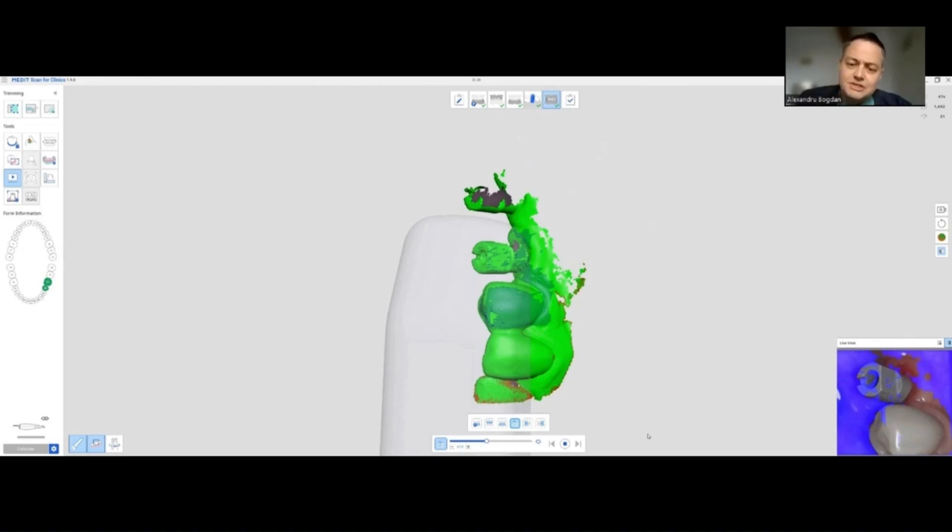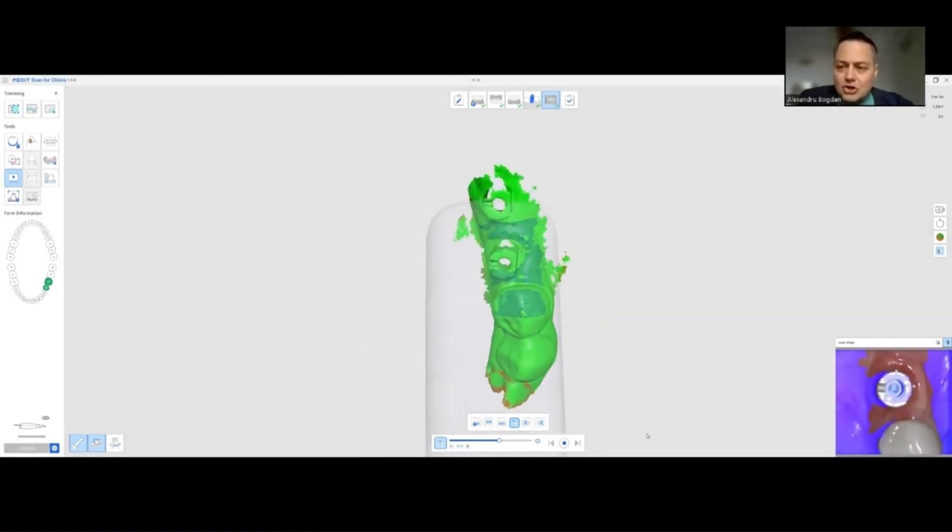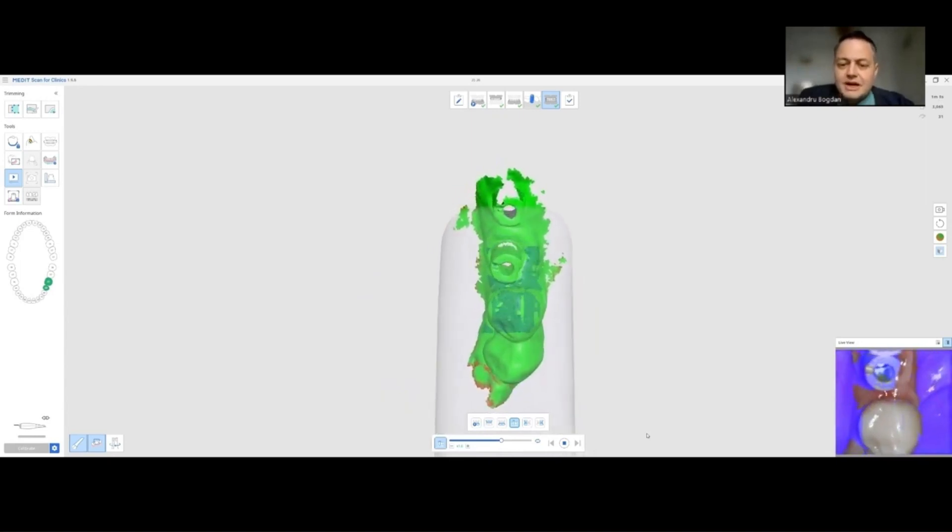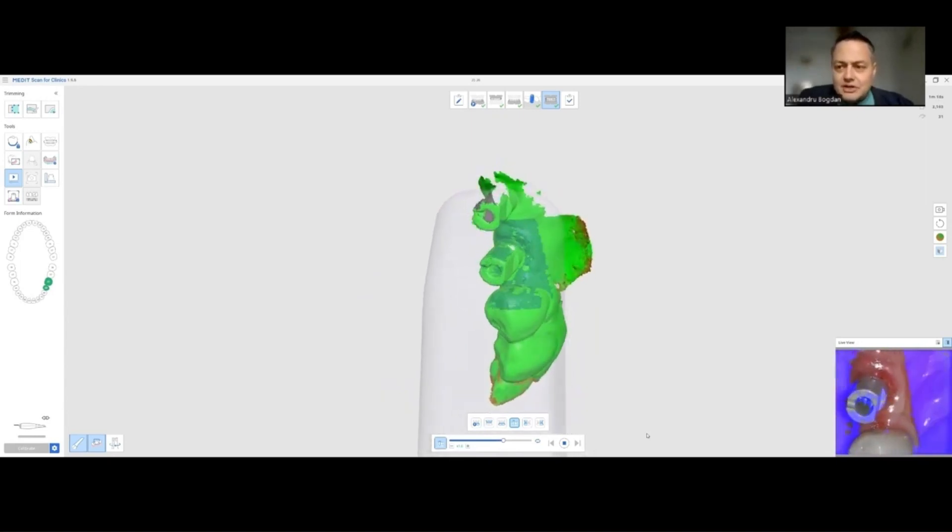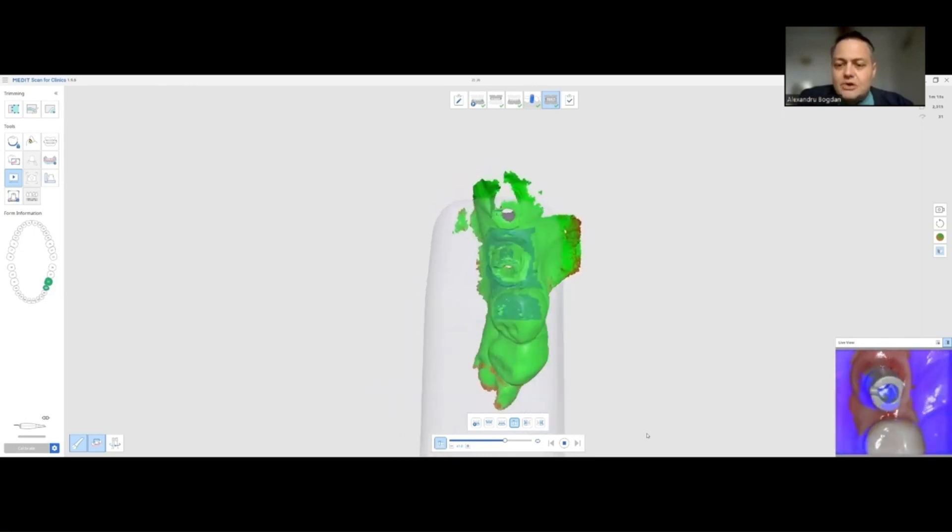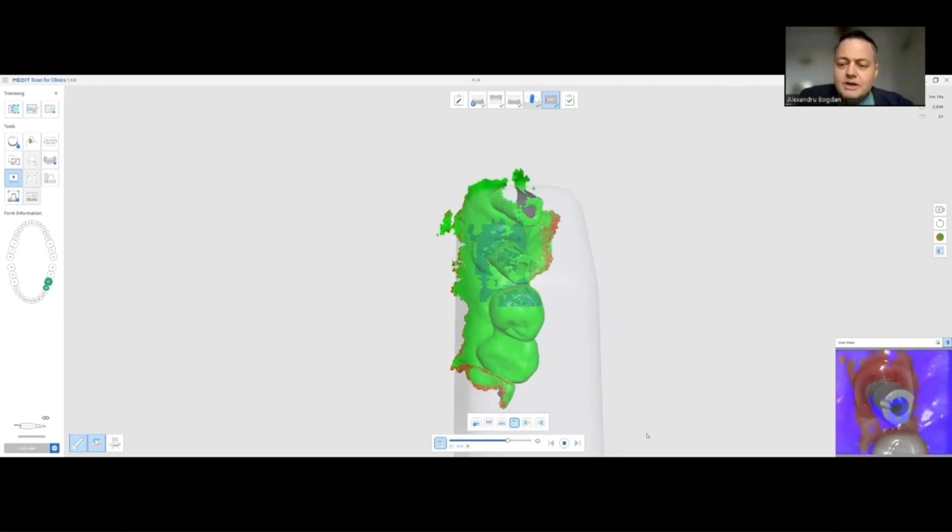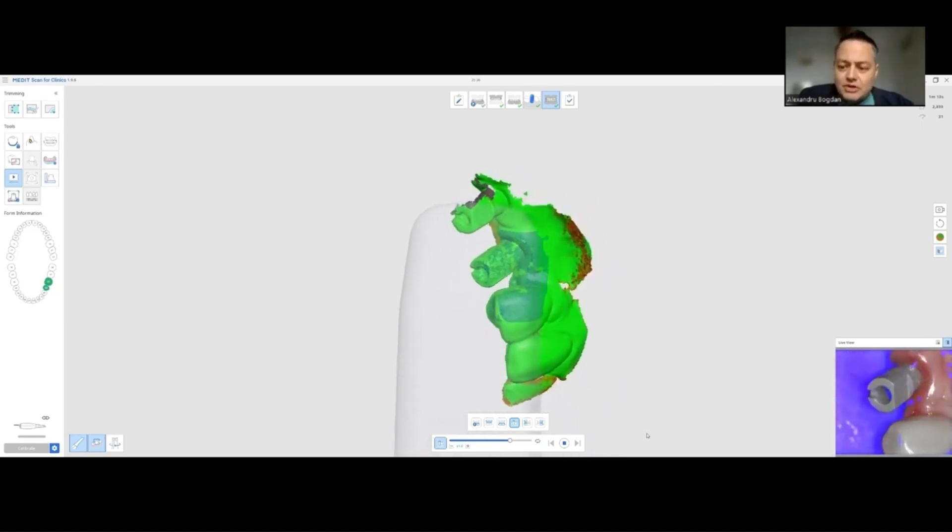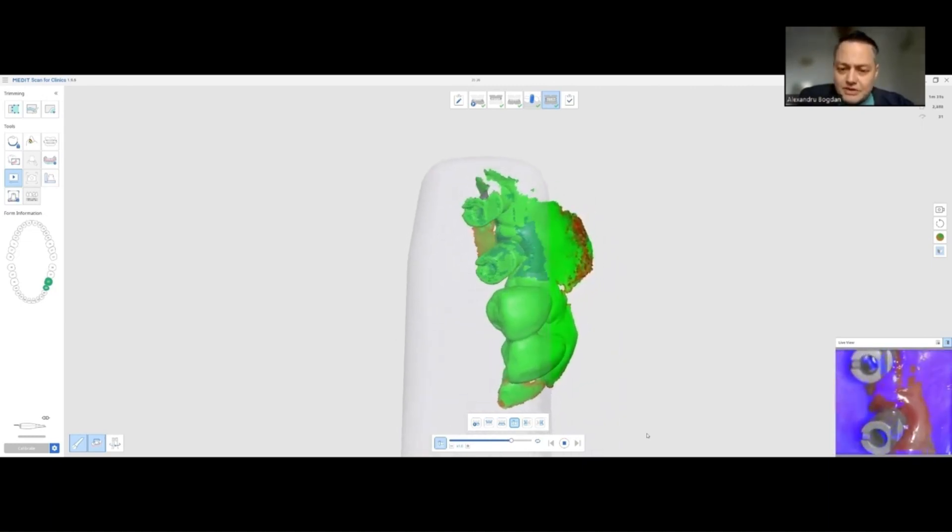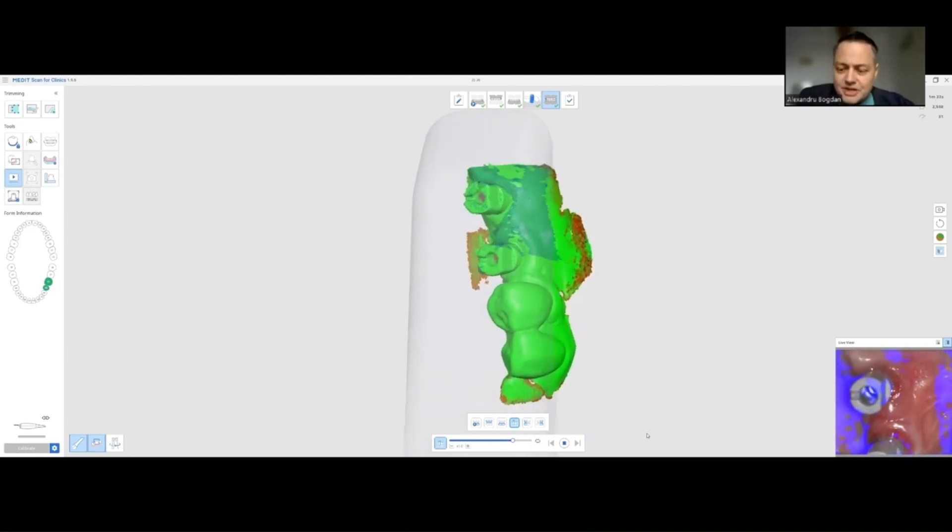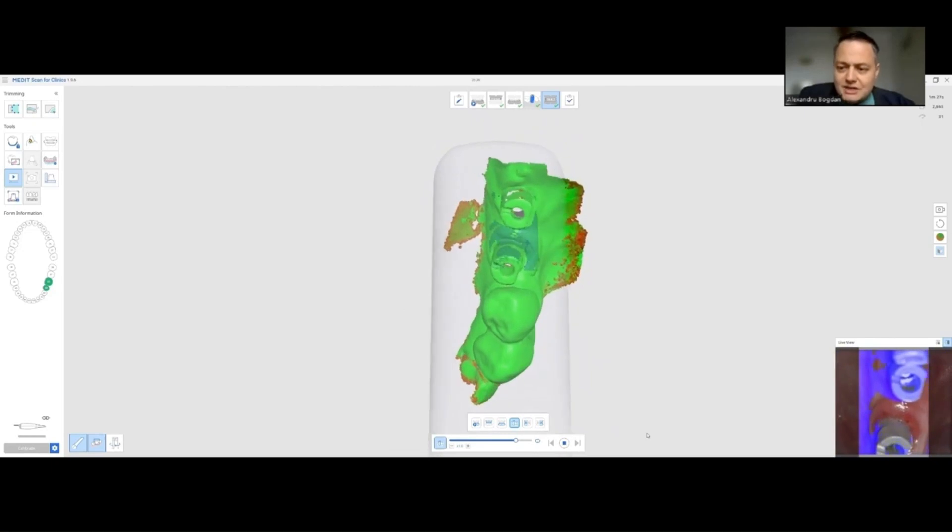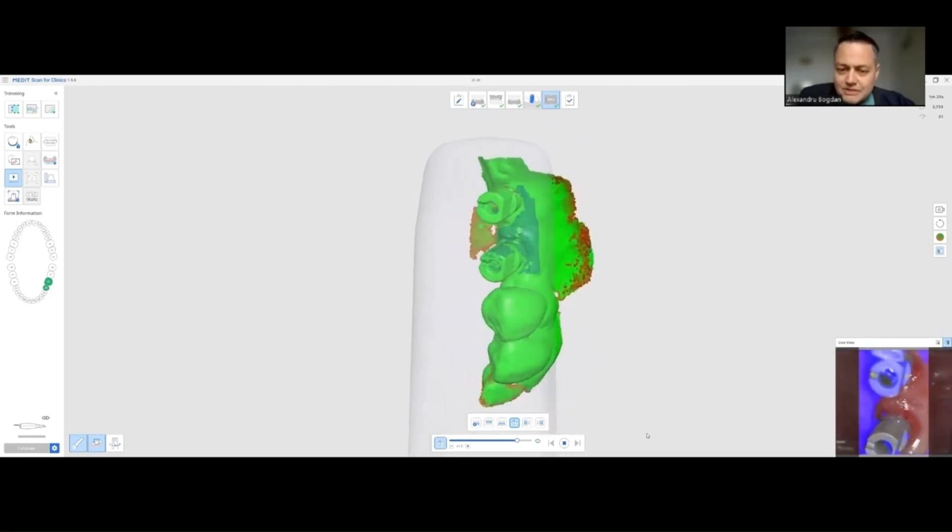The distal side is not complete now. To do this, I am going to go back in contact with the mesial teeth and I'm going to angle the scan tip at an angle of 45 degrees or even more and go to the distal by keeping contact with the mesial tooth. And in this way, the scanner always sees the teeth but also starts seeing the distal part of the scan bodies.